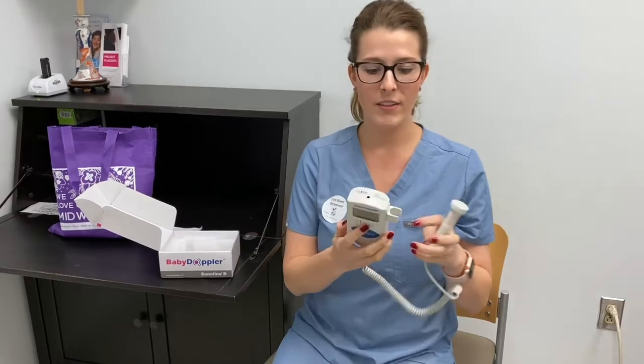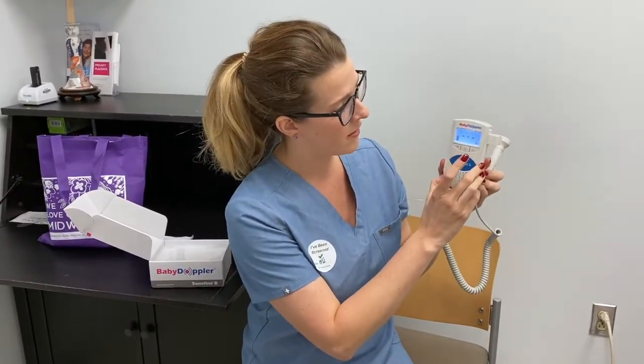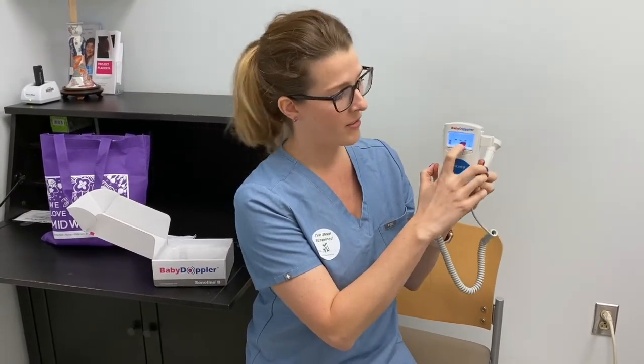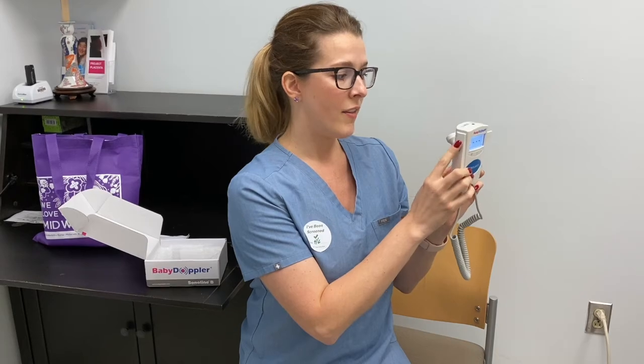All right, so the way this works is you're just gonna cut it on, and we'll listen to baby's heartbeat, and then when you're done, you can cut it off. It does show you the beats per minute right here. There's a volume on the side, up and down.